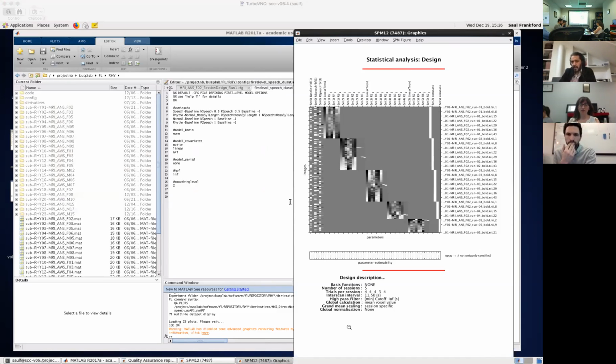I think we are basically sending this information to SPM, and SPM is internally orthogonalizing these things. If that is happening and we want to have control over which thing exactly we do, in answering your question, then we'll need to modify that so that we skip this orthogonalization of SPM, or we can do it manually. We could create these additional columns ourselves and decide at that point whether we want to remove the average of the response time variable within each condition or across both conditions simultaneously. And that would allow us to control for the covariation with duration without removing the potential difference in duration across the two conditions that we care about.